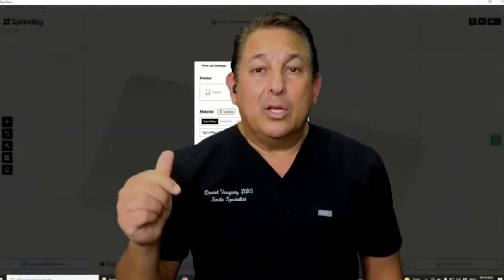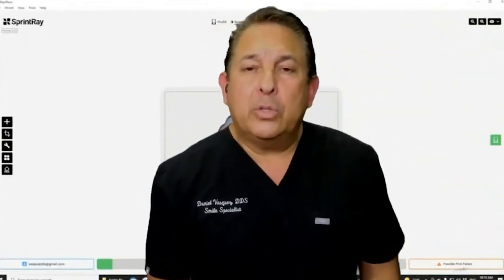Doing these procedures when you have a digital impression device, your dental hygienist and your staff already scan, you design it, they print it, they wash it, they cure it, they polish it, and all I do is come to the patient, they put it in the patient's mouth, and I say, please wear it. That's what I do. And I will tell you that is the best thing that we offer in our practice, the kind of dentistry that I don't have to do a lot. These kinds of procedures are great.